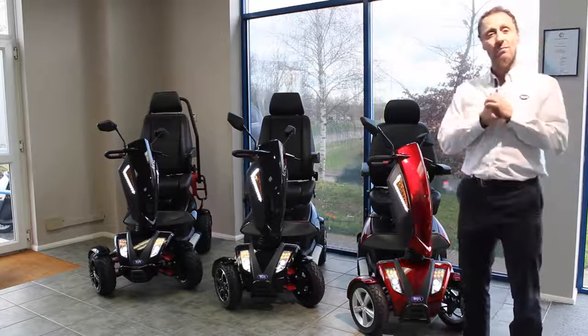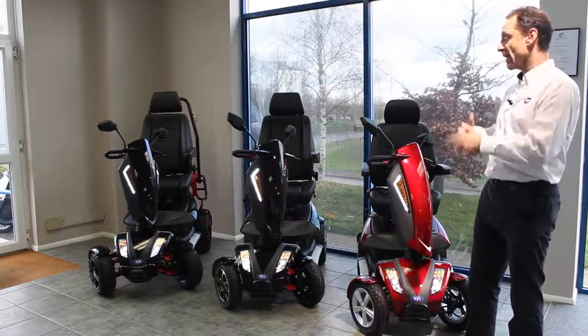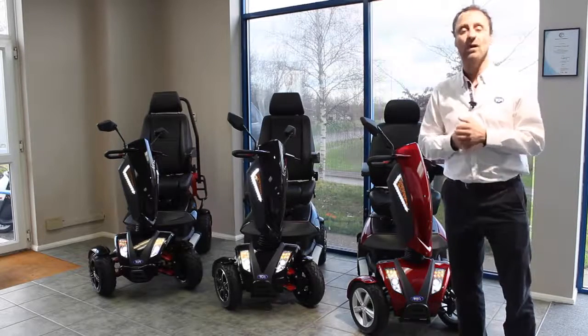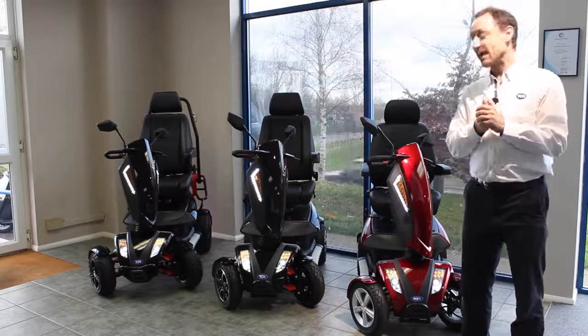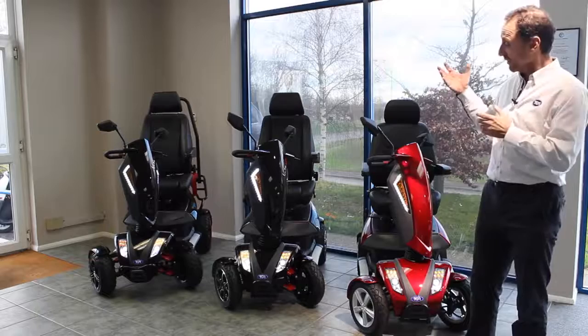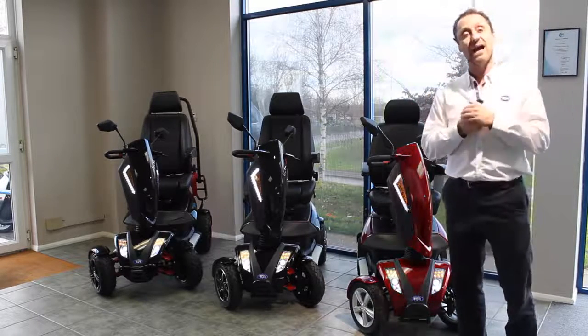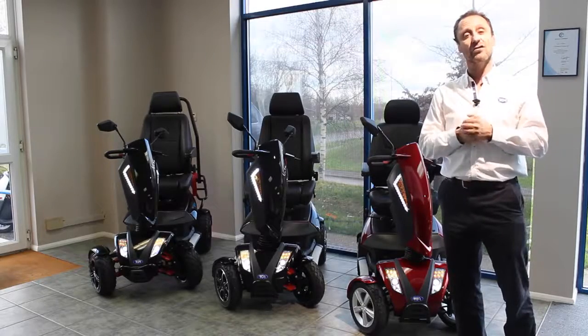They've all got suspension, both front and at the rear, which means you're going to be a lot more comfortable when you're out and about. They've also got low energy LED lights which not only don't use much battery but look good, and they help you be safe as you're going about your business in the darker weather.